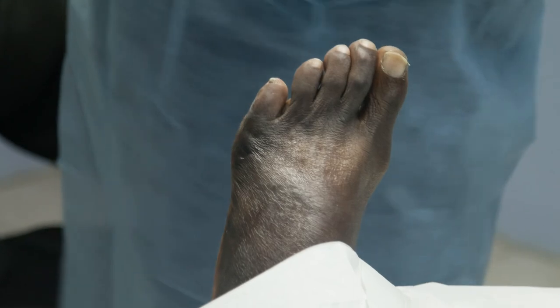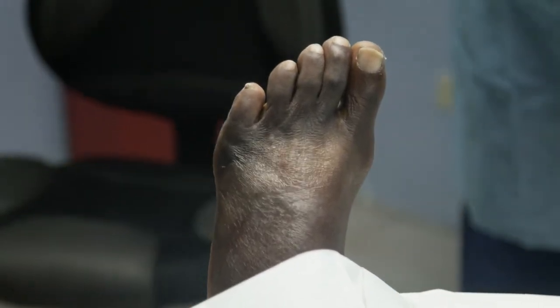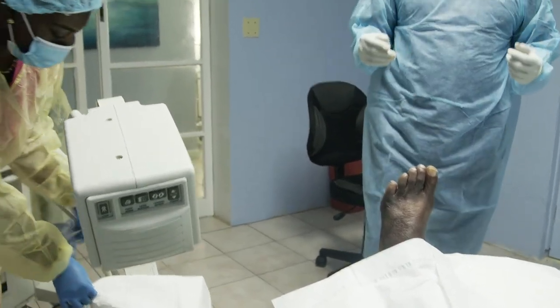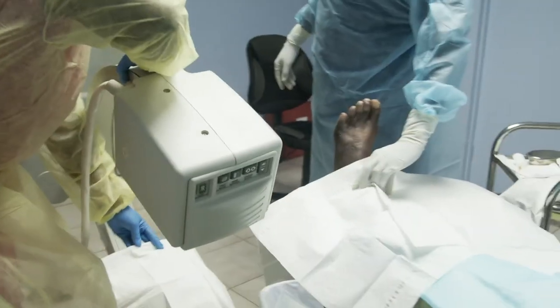All right? Try not to wiggle your toes. Everyone won't wiggle their toes. Wait till she finished taking the picture. Then you can wiggle as much as you like. You got to bring him down a little bit. Or you just let him put his foot on it. Okay? So this is going to come to you. Follow her instructions. And she's going to tell you to put your foot over and down.